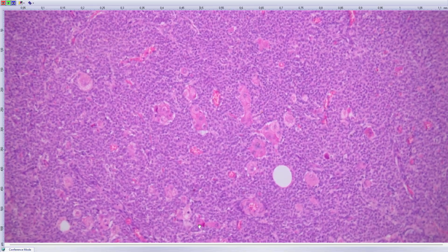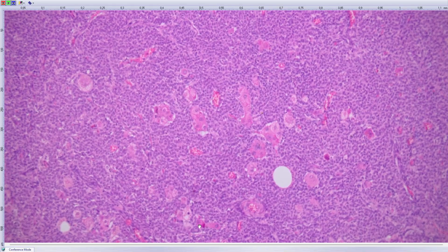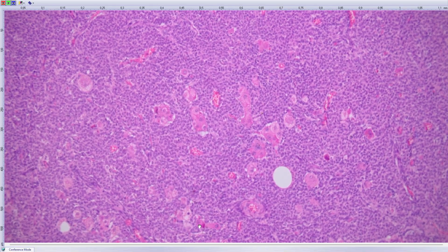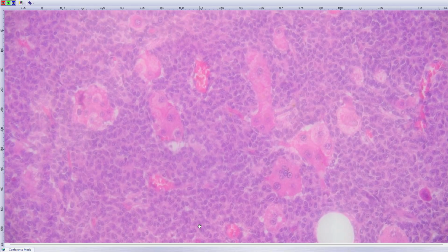It was described by Robert Scully, several cases. I will send you a paper on it. Yeah. So at first it was called hepatoid, but it's not hepatoid, it's really hepatic, because we have a case that has even bile in it. Yeah. But important is that it makes the diagnosis granulosa cell tumor for certain, because I never saw it in any other case in human pathology. Yeah? We have three or four cases of this. Amazing, a different look at it.